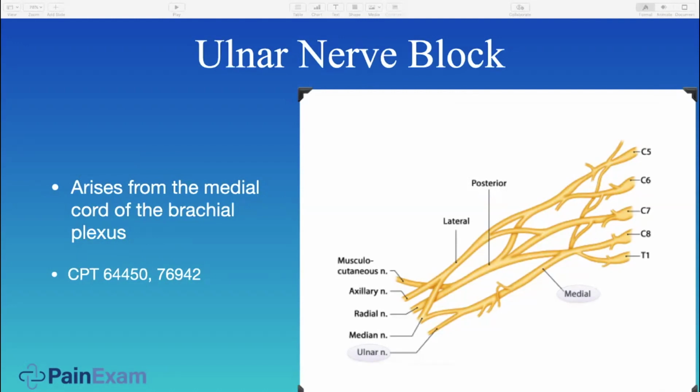Ideally, you want an image in which you show the needle next to the target tissue. And unfortunately, if you're using a thin needle like I do, you may not always press save for the image at the exact time where you see it, but that's the way you're supposed to do it.